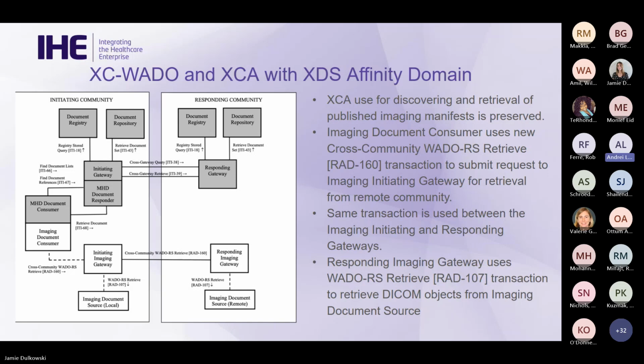So a couple of notes on this definition. One is the definition of the cross-community WADO RS retrieve transaction and associating it with both communication between imaging document consumer and imaging gateway, and also between gateways, allows for a very explicit definition of what can be done and cannot be done, and how things operate in the cross-community environment.